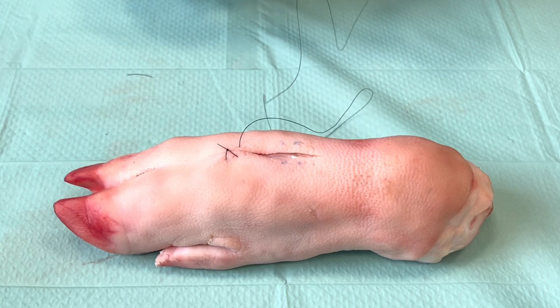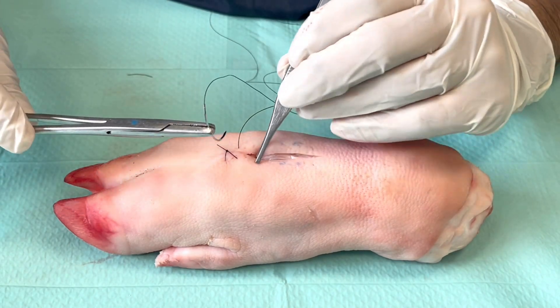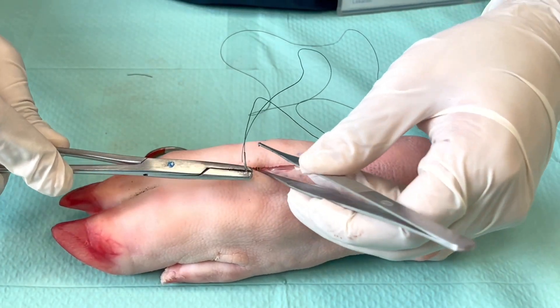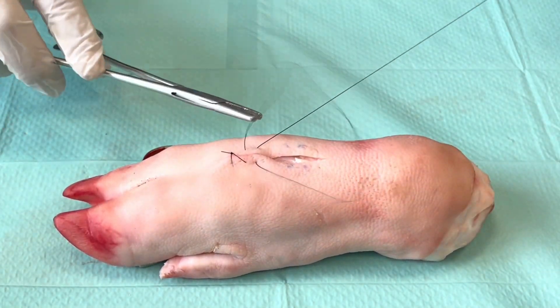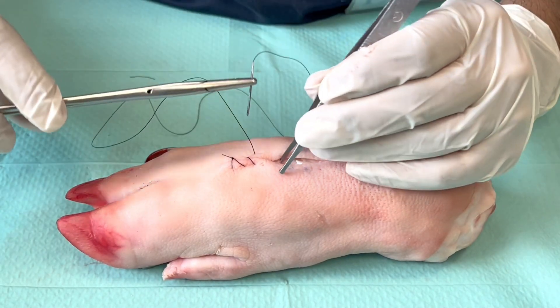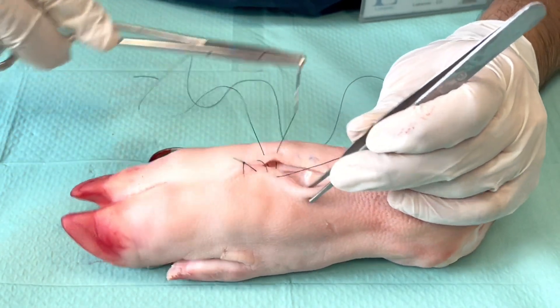Ideally you will have an assistant helping you pull up on the thread and maintain this tension, but you also need to know how to do it by yourself and manage the thread, because sometimes you won't have an assistant with you. We keep taking these bites in the same manner, covering the wound at about the same distance from the previous bites, until we reach the end of the wound or incision. We take a bite across the wound about the same distance from the wound edge.